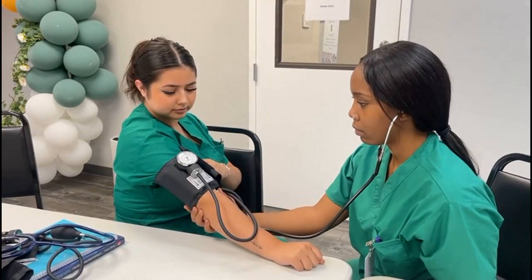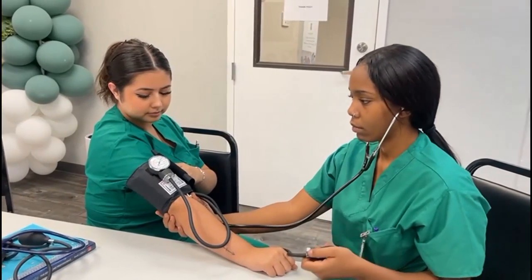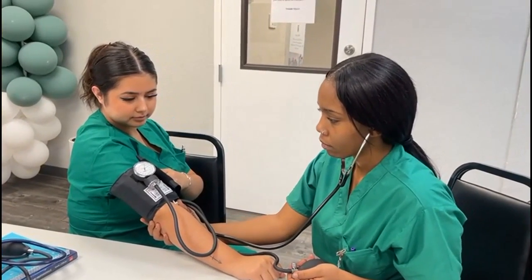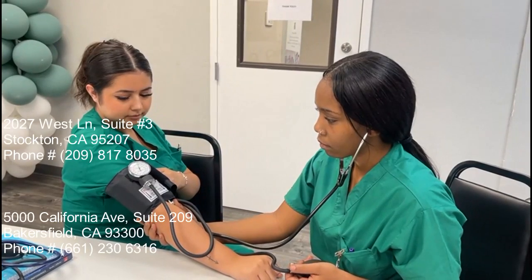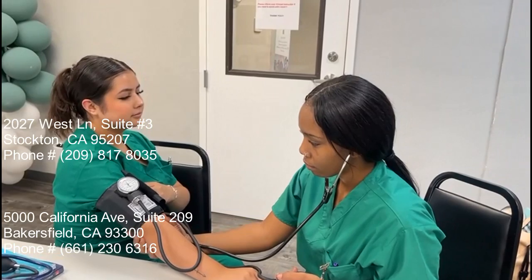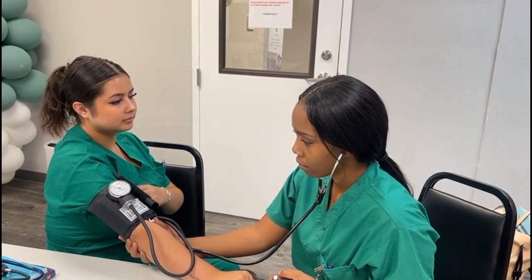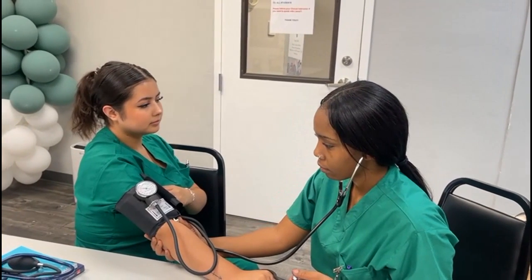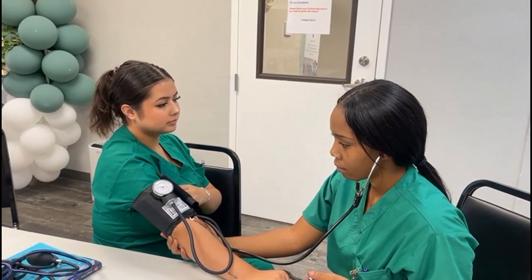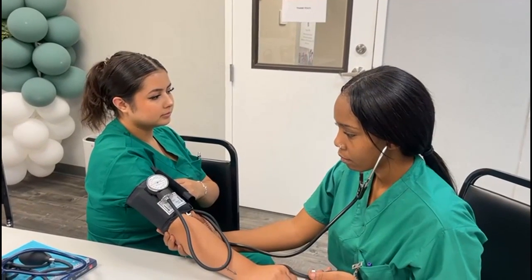We're going to come to about 200 millimeters of mercury. Once we hear the first beat, that's going to be our top number. And then the last beat is going to be our bottom number.